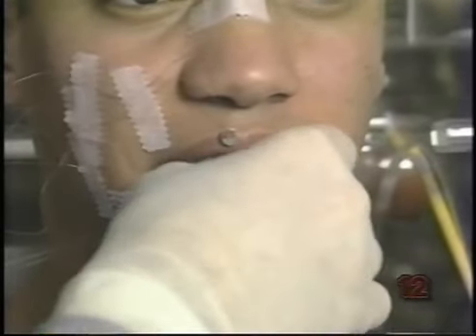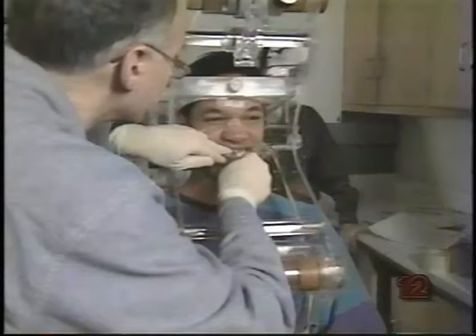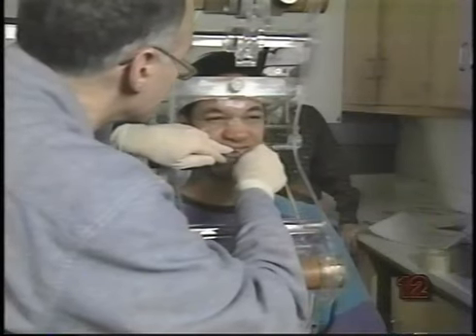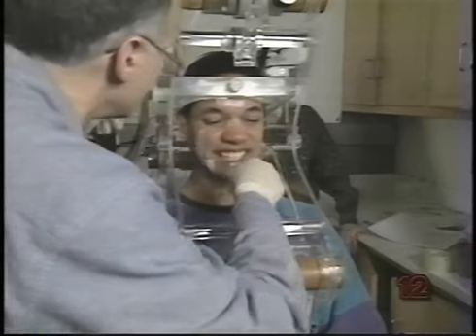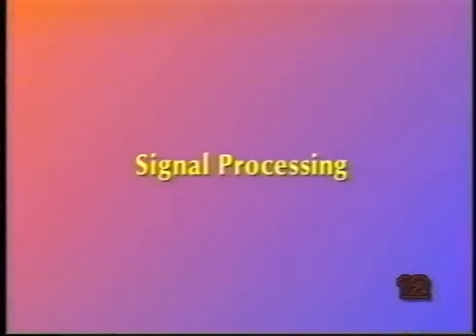The more anterior transducer is positioned just forward of the upper incisors. When the experiment is over, the transducers are removed carefully from the subject and the transmitter assembly is lifted off. Next, we run a program that performs the signal processing.